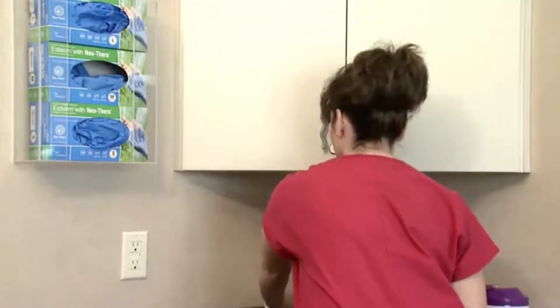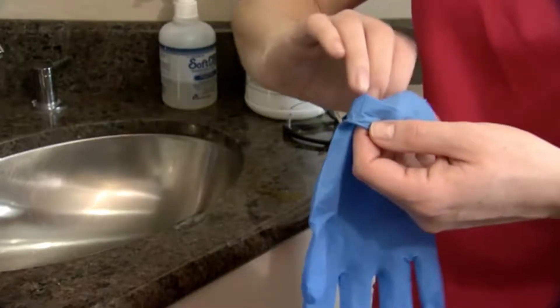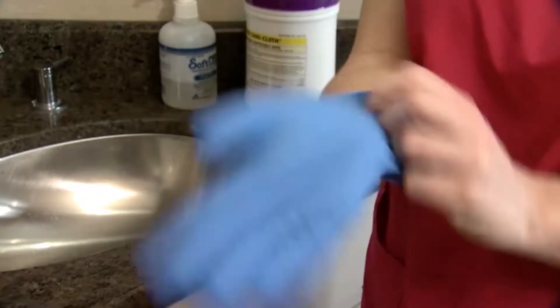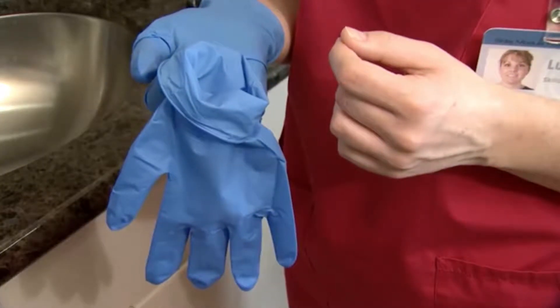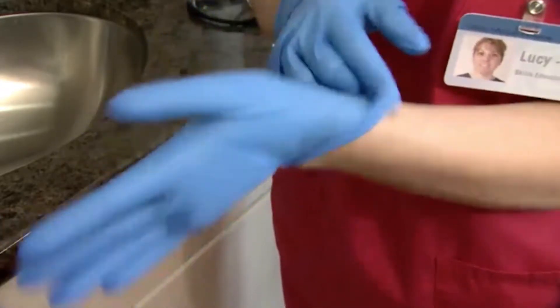After washing hands, select the appropriate size gloves. Holding the glove at the opening, slip the fingers into the glove and pull tight. Next, using the gloved hand, hold the second glove at the opening and slip the fingers of the un-gloved hand into the glove and pull tight.